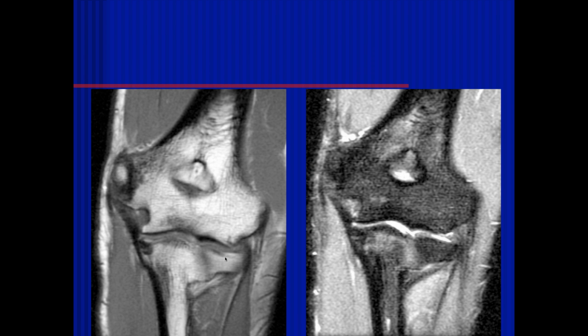Here again, we're looking at that ulnar collateral ligament, and there's some slight irregularity of the sublime tubercle, and some increased signal proximally. And there we can see an ossific fragment along the medial epicondyle. I'm not sure it's corticated, so it could be a remote injury of the common flexor.